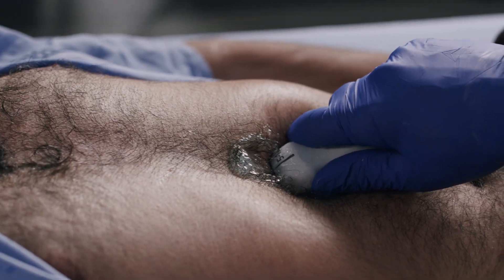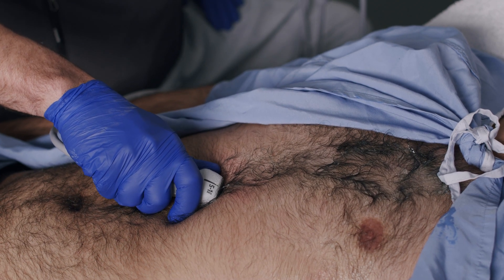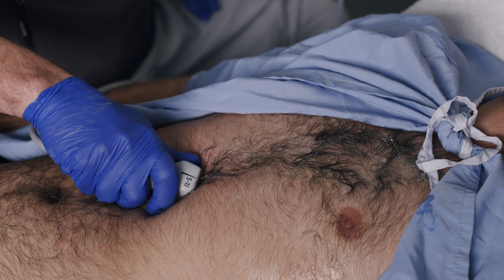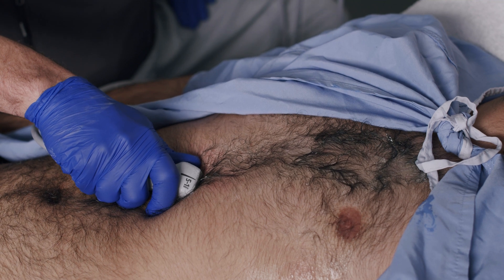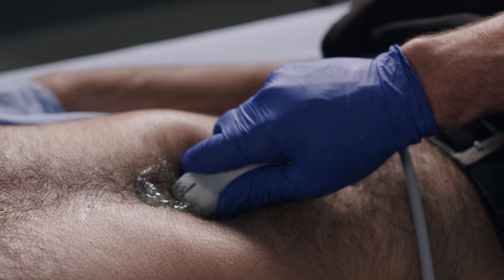We position the patient differently for this view. The patient should be supine with their knees slightly bent. Sometimes this is the only view available in ventilated patients or those with severe COPD. The view is enhanced by asking the patient to hold inspiration. Either a phased array or curved linear probe is appropriate. We will start with the subcostal four-chamber view. For this view, we change the grip on the probe to the overhand or ice cream scoop grip, which allows us to better push down on the probe.